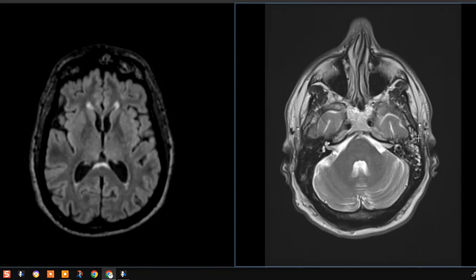Deep to the ear we see the region of the temporal bone called the mastoid portion of the temporal bone, and we see this is asymmetric. On the right we see darkness — this is filled with air and little bony struts like honeycombs, and this is normal. On the left side, those air cavities are filled with fluid which show up as bright, so this patient has fluid or inflammation within these mastoid air cells.